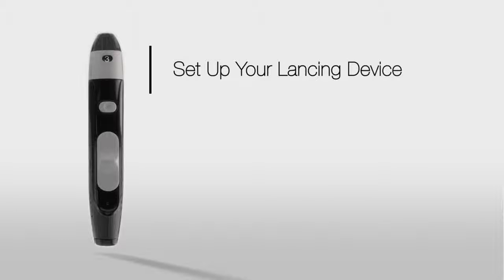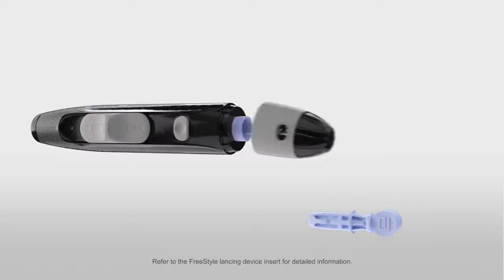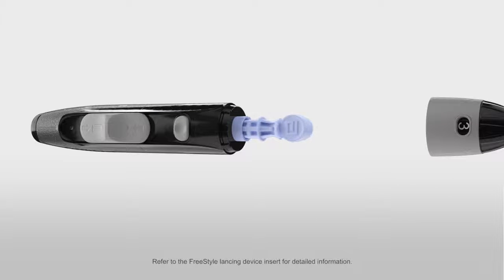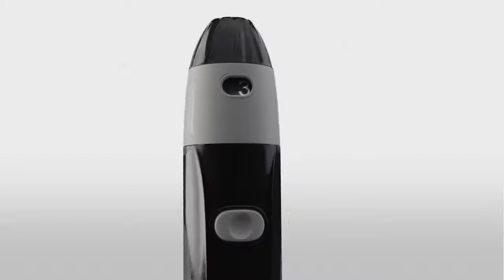Next, let's set up your lancing device. To use a new lancing device, just snap off the cap and insert the lancet into the holder cup on the lancing device. Twist off the rounded top and replace the cap. Then move the dial to the desired setting of the lancing depth. Begin on 1 for the shallowest setting, and increase the dial if more depth is needed.